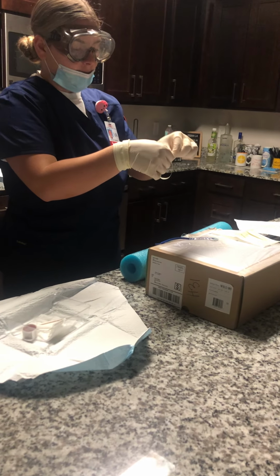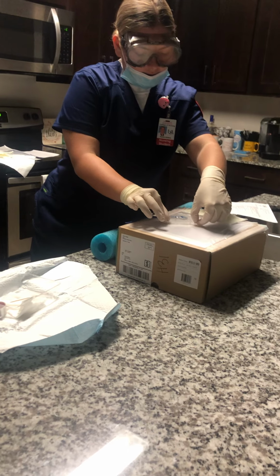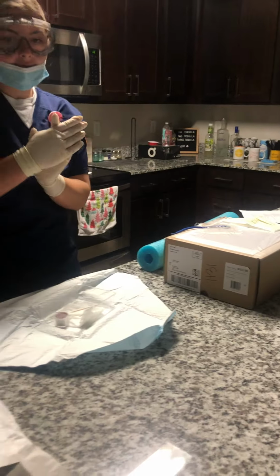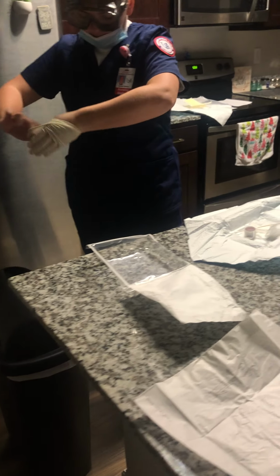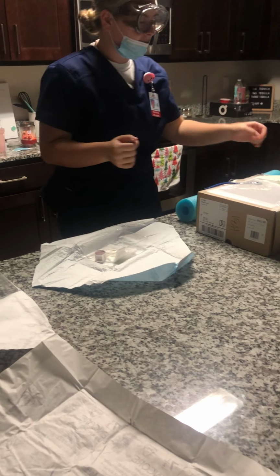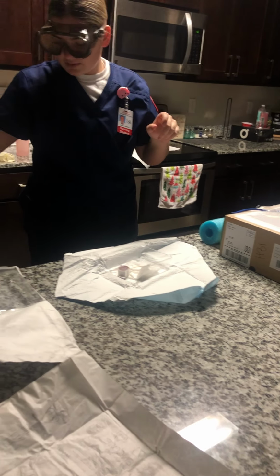So this has my initials, the time, and the date. And I'm going to place this on the patch, but you don't want to place it on the insertion site. So now that that has been placed, I am going to remove my gloves and dispose of my supplies. Well, I'm removing my gloves. So I can remove the patient's mask now, dispose. I can remove my mask now and dispose.